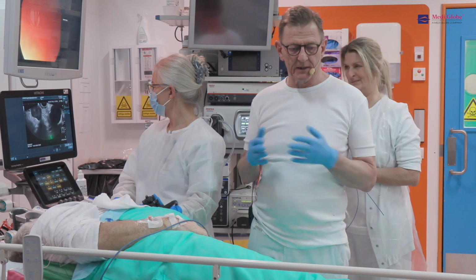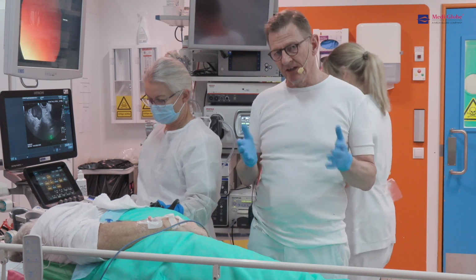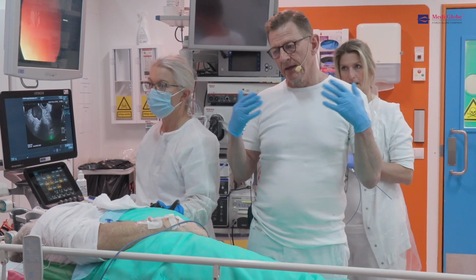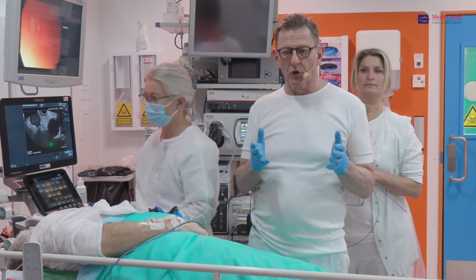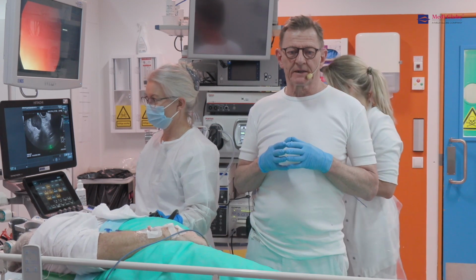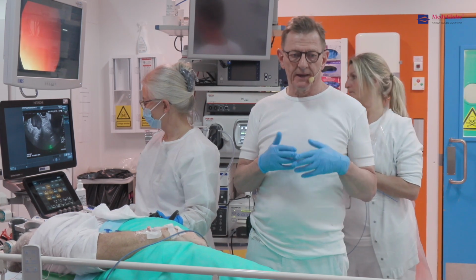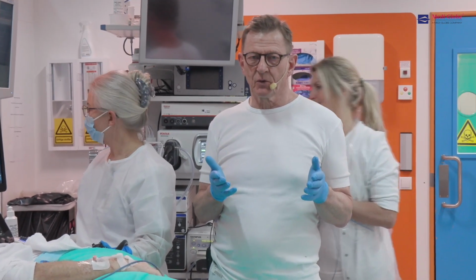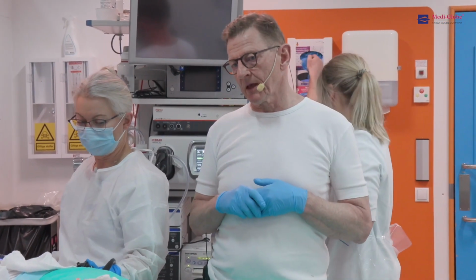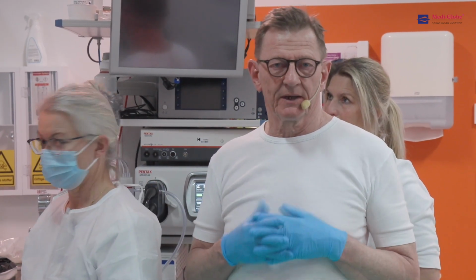The patient history has been evaluated on an MDT conference, and they decided that an EUS-guided biopsy should be taken in order to find the exact diagnosis. Because if resection is advisable, this is going to be a Whipple procedure, which is quite a big surgical procedure in a patient with lots of comorbidities. So this is, of course, an important question.